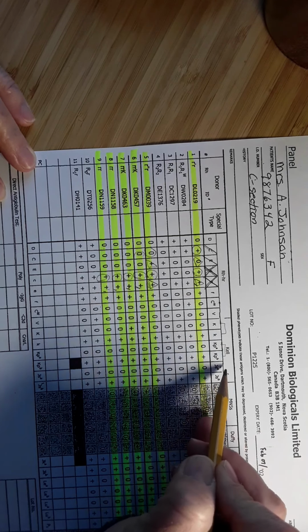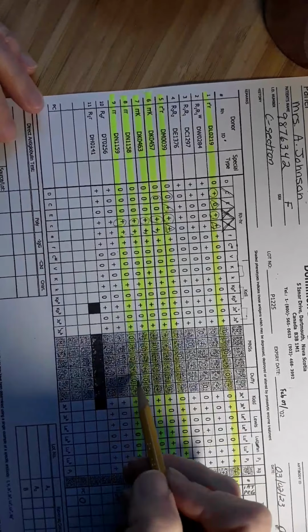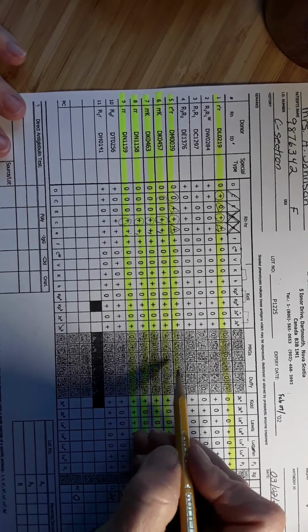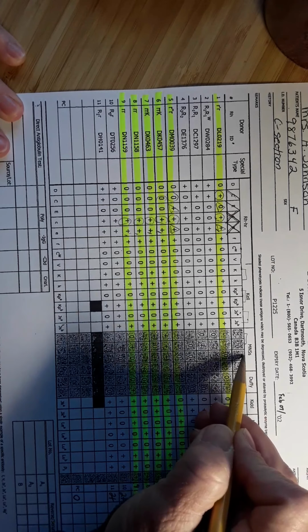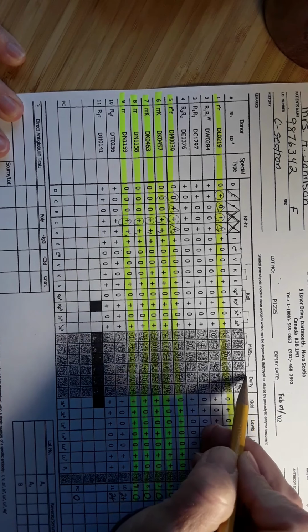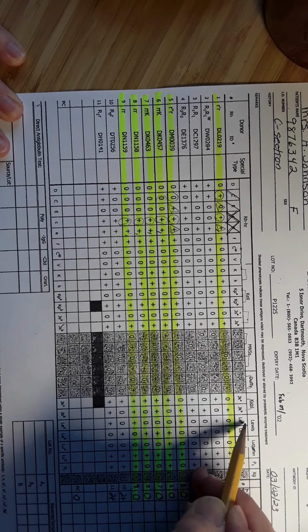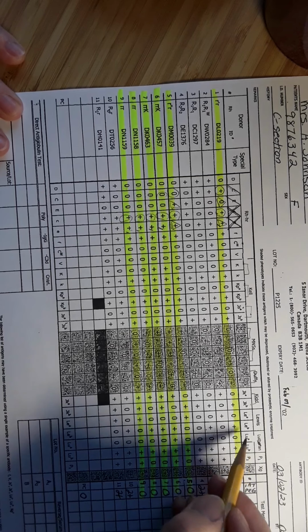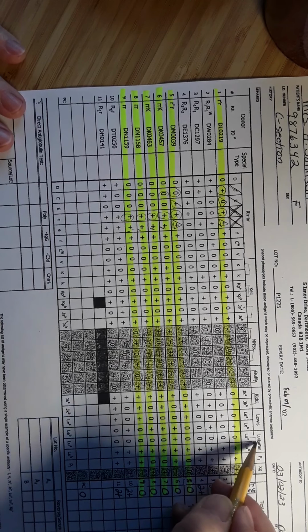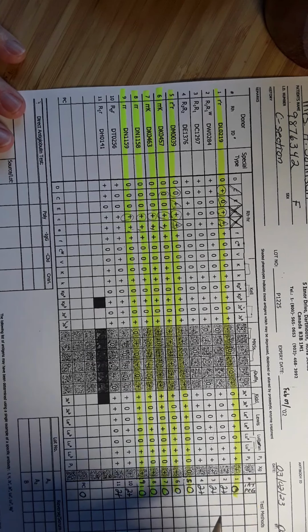Kpa, Kpb, Jsa, Jsb. It's a little bit hard for you guys to see this grayed out area. It'll look better on your copy. M and N are a pair, S and little s, Fya, Fyb, obviously Jka, Jkb, Lewis a, Lewis b. They aren't allelic pairs, so I won't do that. Lutheran a, Lutheran b are. P1 stands alone and Xg stands alone.